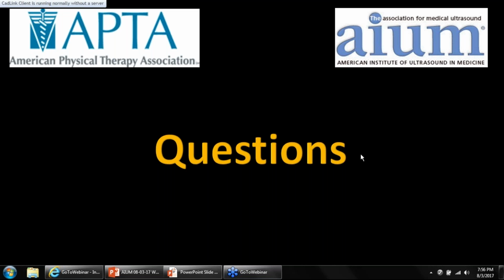Next question, do you routinely incorporate EMG, NCV studies combined with sonography in your examination for suspected peripheral nerve problems? Yes, I do that, and it's invaluable. I think we don't have enough time, but I have great cases that I would have missed. I would have missed a lot of details if I missed one or the other. So I think together they complete the assessment of the problem. When you're doing the electrophysiological studies, you're looking at the function of the nerve. When you're doing ultrasound, you're looking at the structure. So it's function and structure. You want to see both.